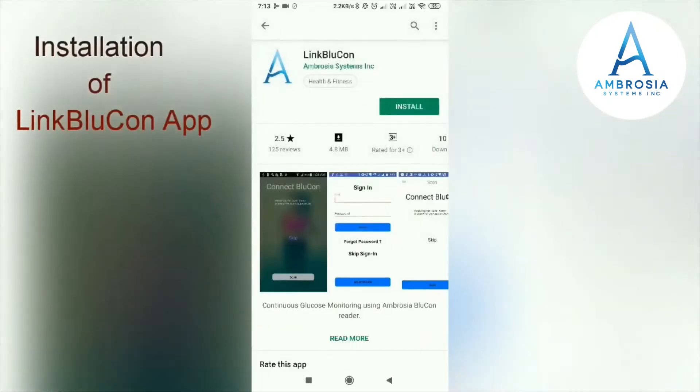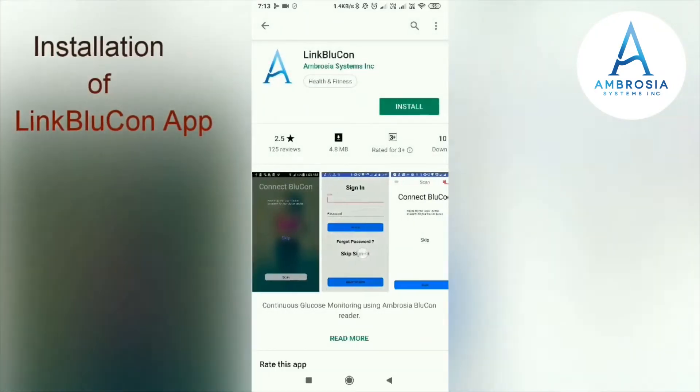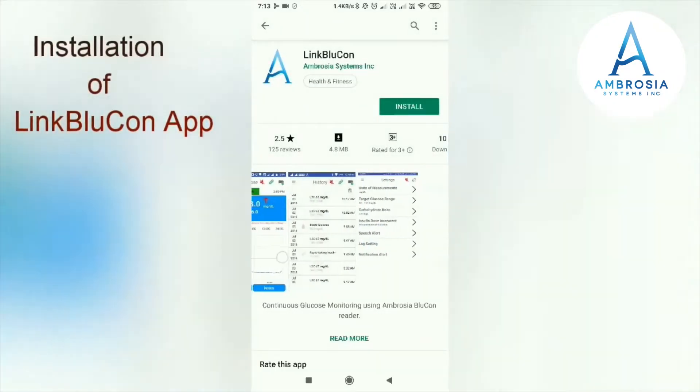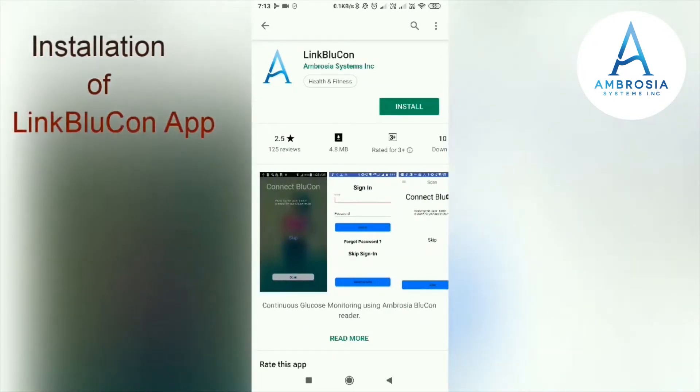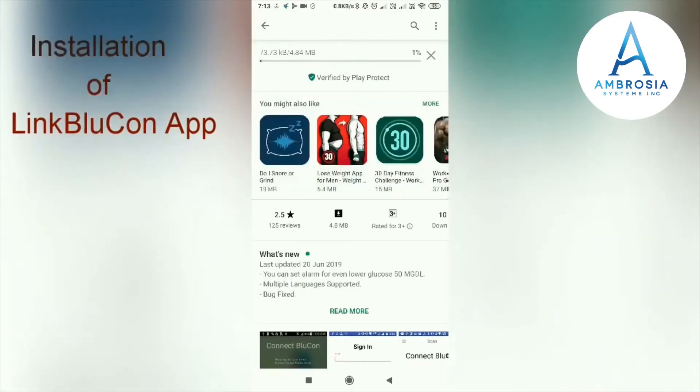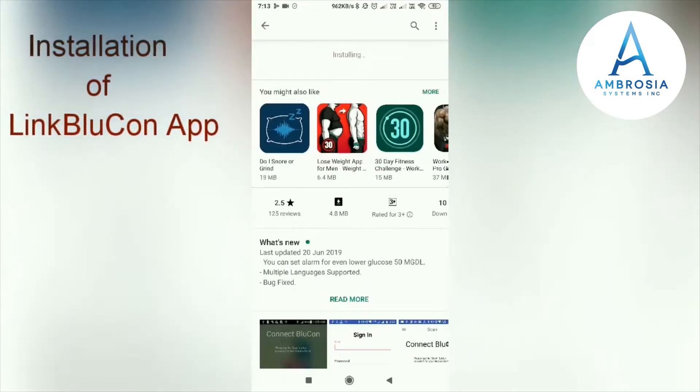Click on Install. The installation process of the LinkBlueCon app takes a few seconds. It's installing now. Opening the LinkBlueCon app.